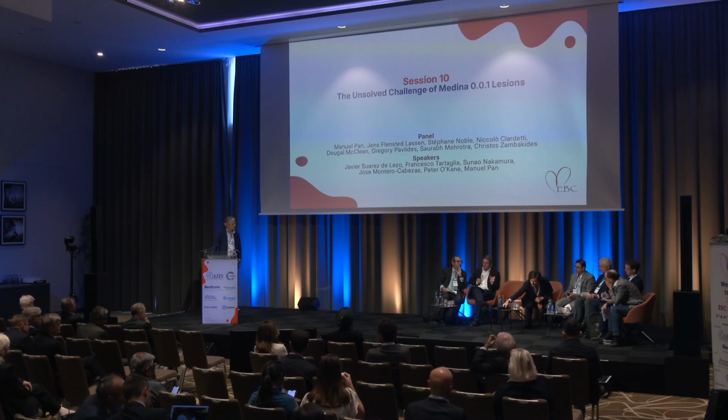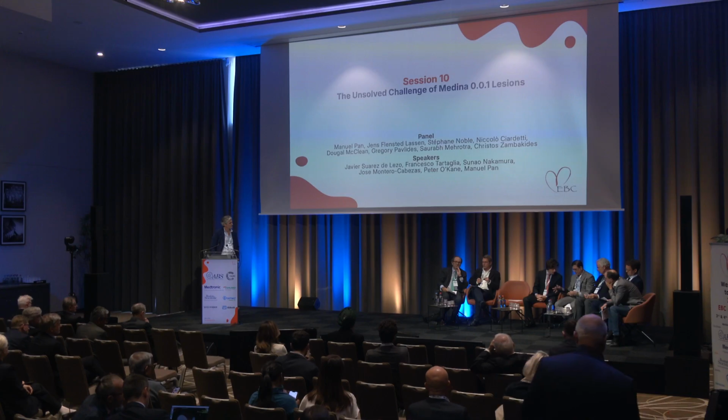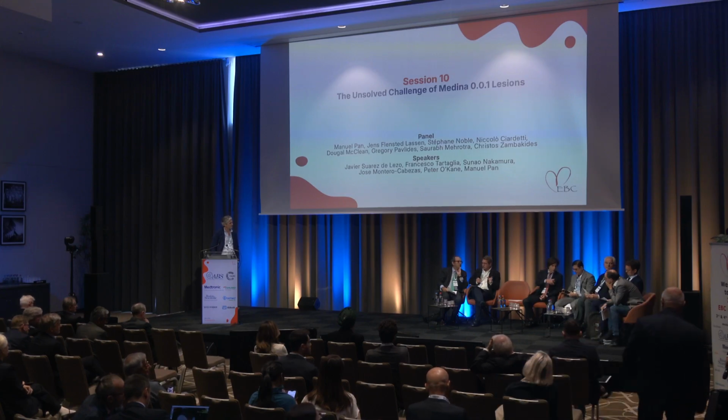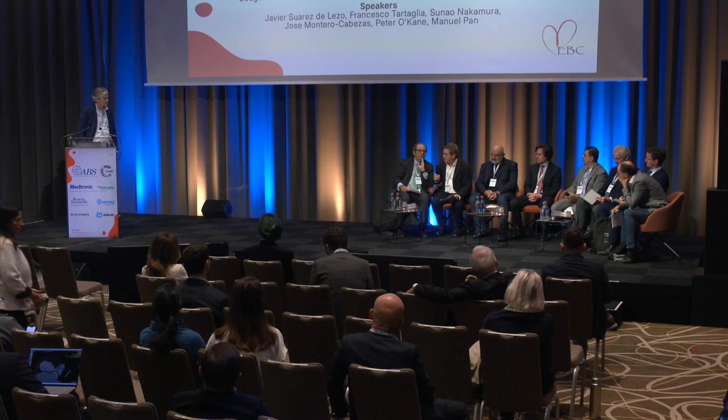And we have heard from the discussions yesterday and a lot of other discussions in other meetings that where we really see long-term follow-up problems, it is in the roof of the circumflex in the left main, and it's in the roof of the side branch in general non-left main bifurcations. So there's something about the technique we are using, something about the perception, the geometry of the lesions that actually made that roof of the side branch vulnerable for late events.